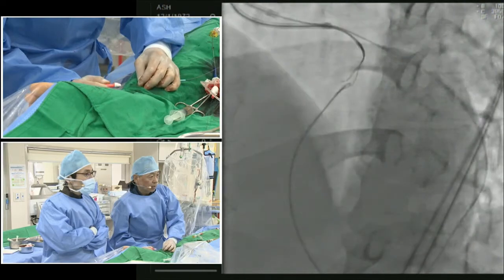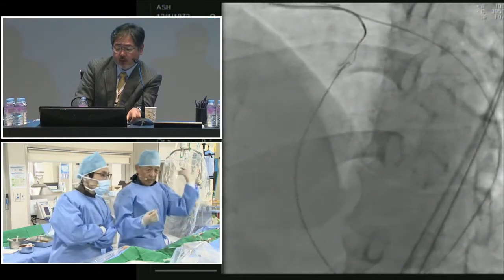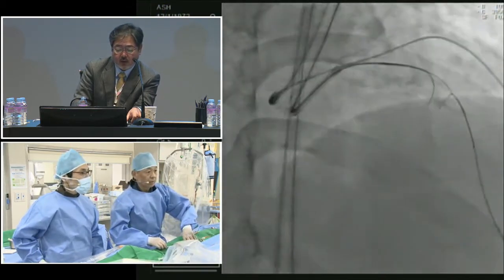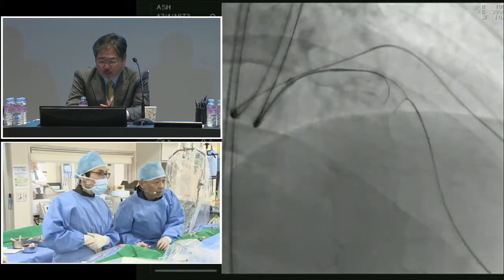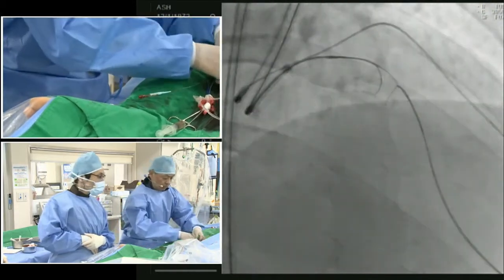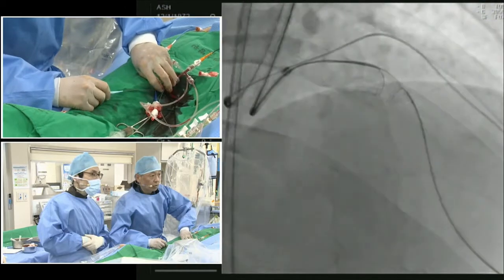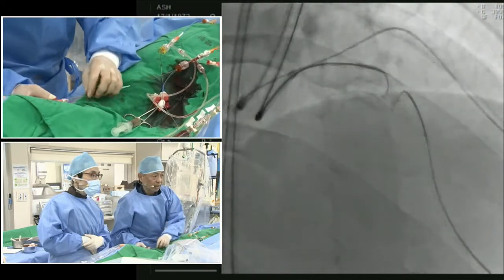Yasumi Sensei, in this moment, which is better as a distal landmark, lateral wire or lateral tip injection? Which is better? How do you think? Just a moment. Under this condition, I try to advance. No advance of microcatheter.